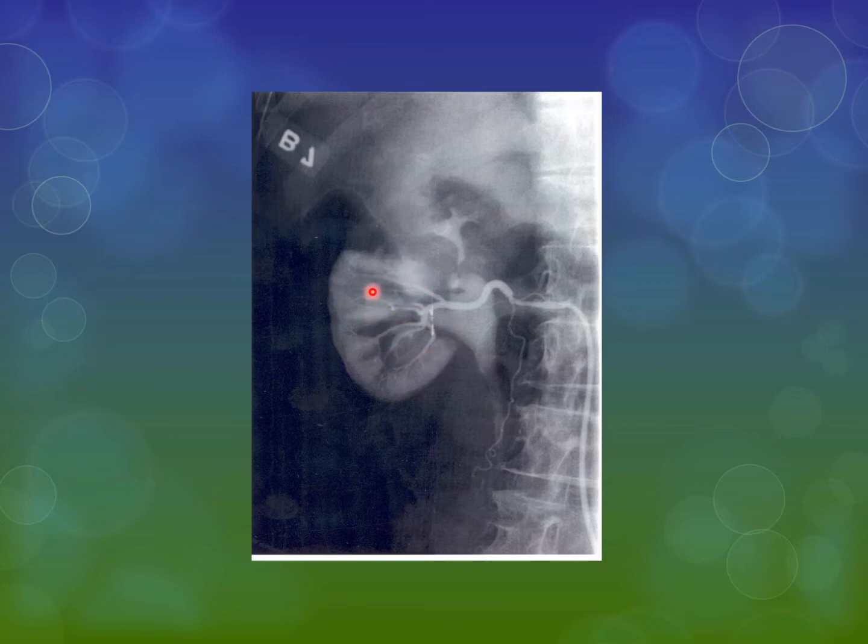More than likely, the reason for that is if you follow this back, I'm going to circle it. Do you see the area that I'm circling? Do you see how this is pretty fat, and then there's this stricture right there? Well, that stricture may be preventing blood flow from going to the upper part of the kidney.